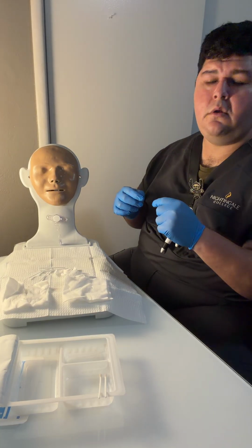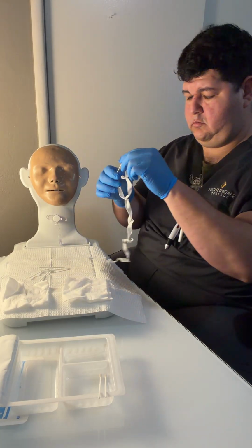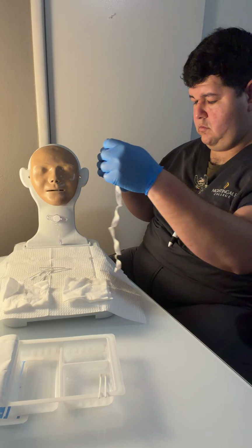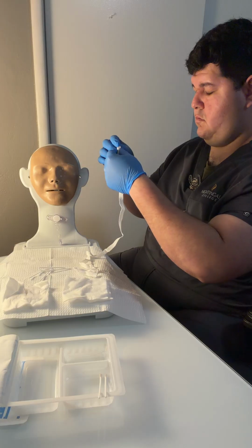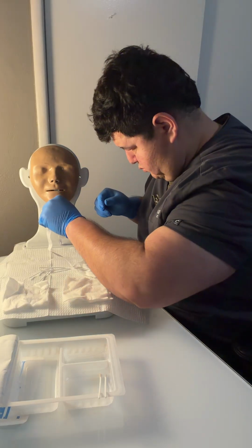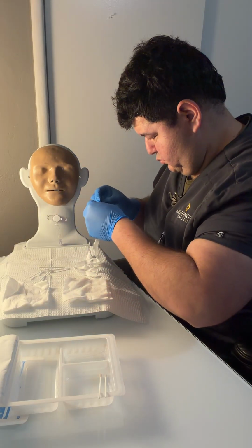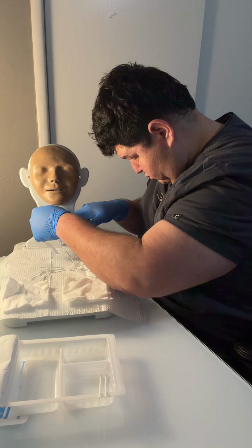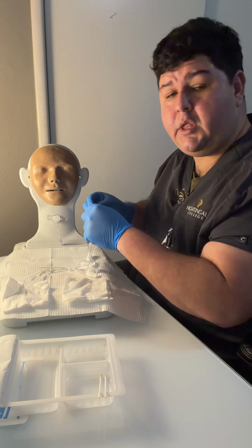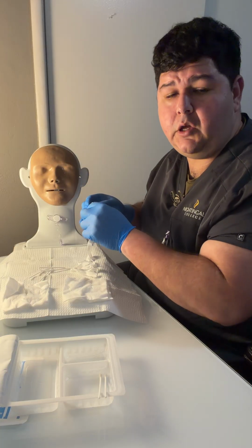Assuming that I have the 2 people, I can let go of the trach.